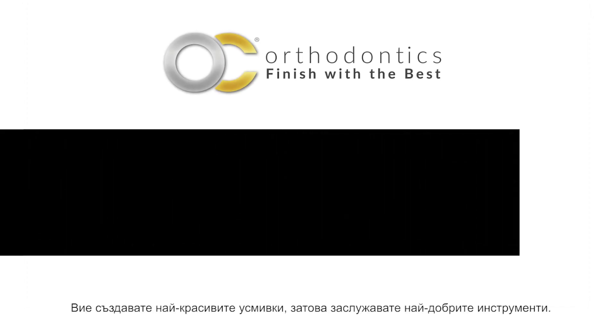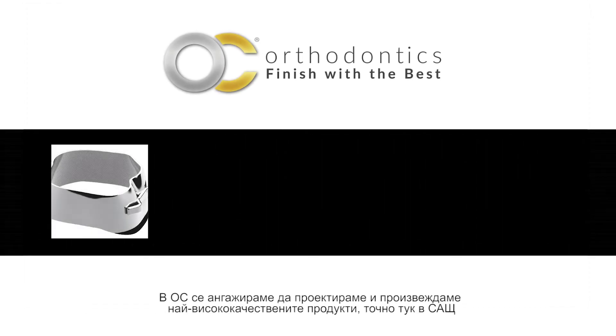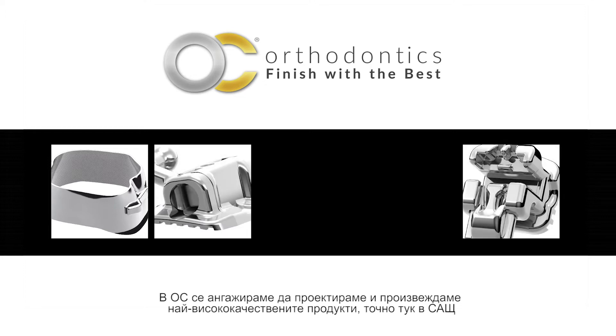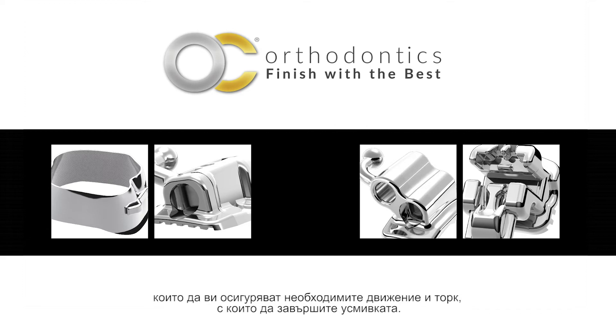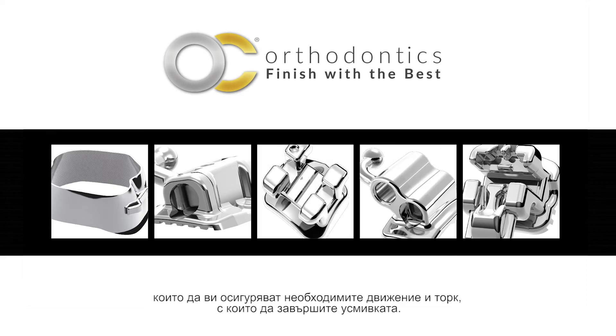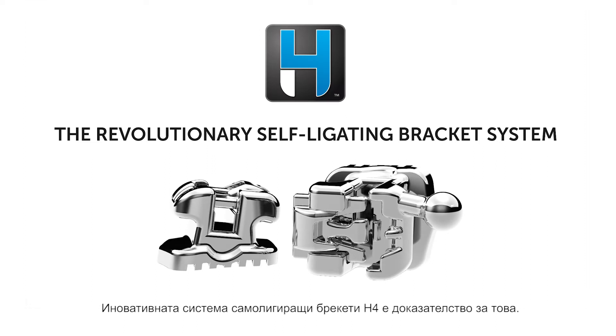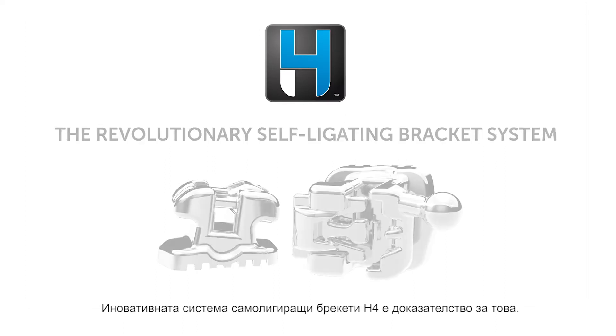You create the best smiles, so you deserve the best tools. At OC, we are committed to designing and manufacturing the highest quality products right here in the US, to deliver the movement and torque you need to finish beautiful smiles. Our revolutionary H4 self-ligating bracket system is proof of this commitment.